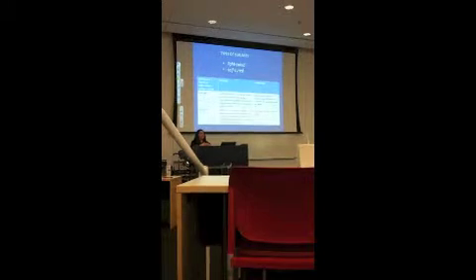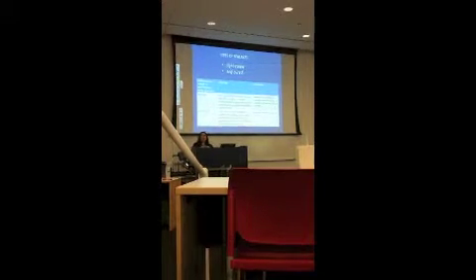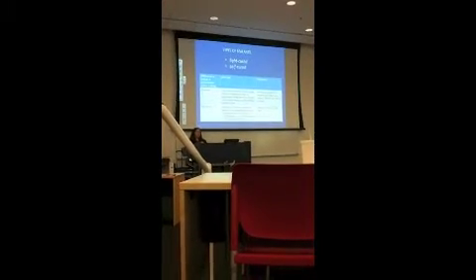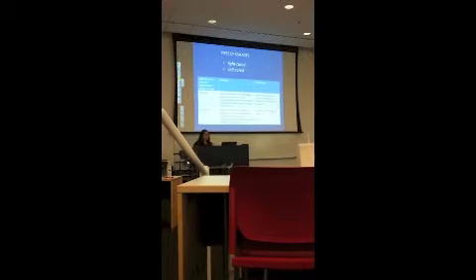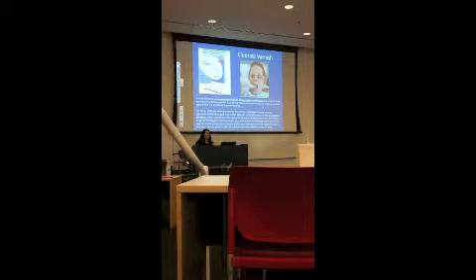But I have not seen it in private offices. Maybe there are offices that use it out there. I'm not sure about your clinic here that you're going to be assisting at. For the self-cured sealant, it usually takes about 2 minutes for it to set up, okay? So the one nice thing is that it is forgiving as far as moisture.